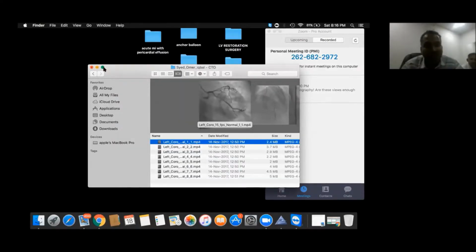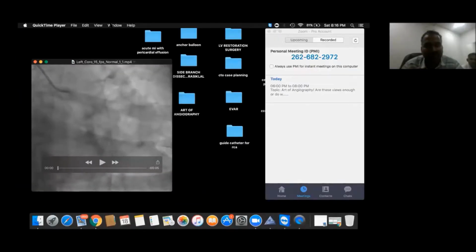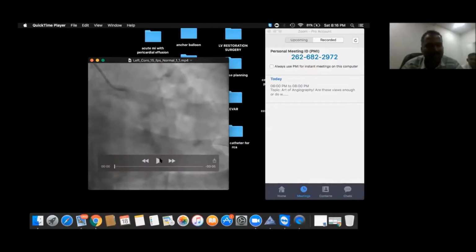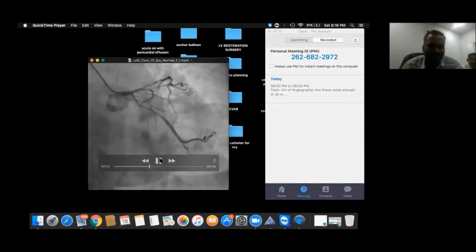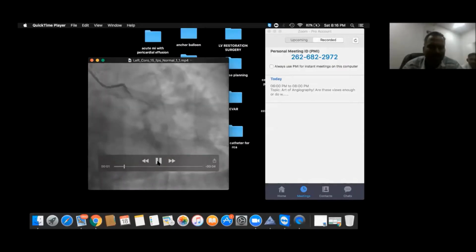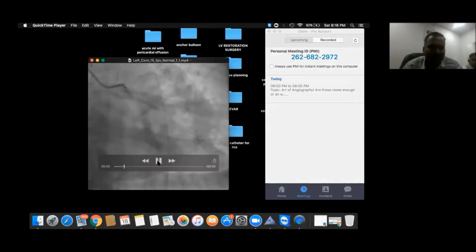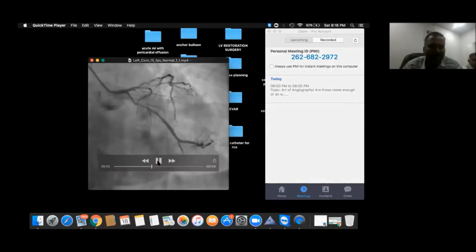I'll show all the views, and then I'll ask. We'll discuss. This will be our last case today. One of you can give a running commentary of what you're seeing. Sridhar, you can give a running commentary.